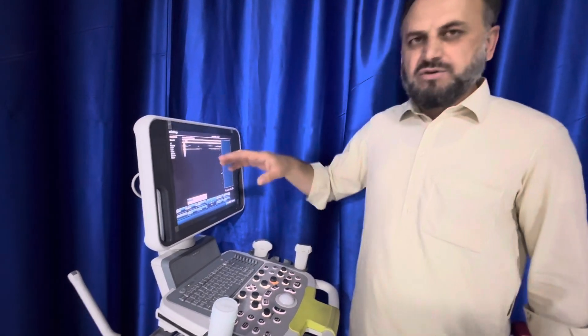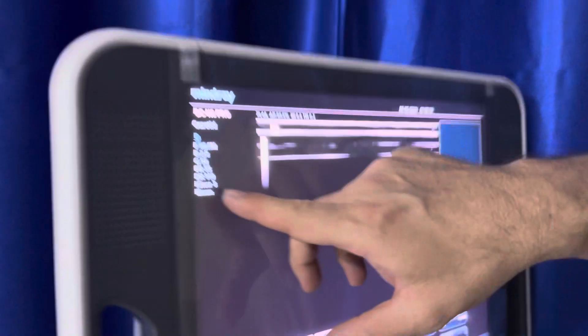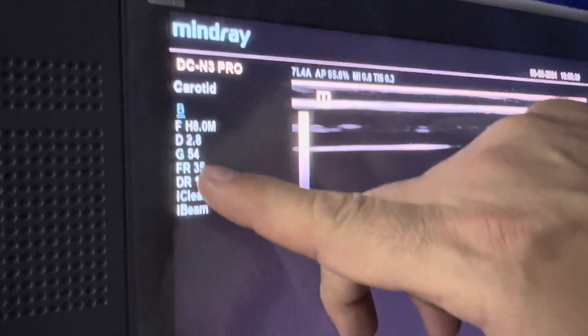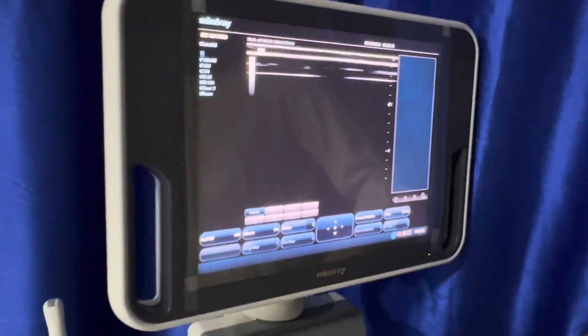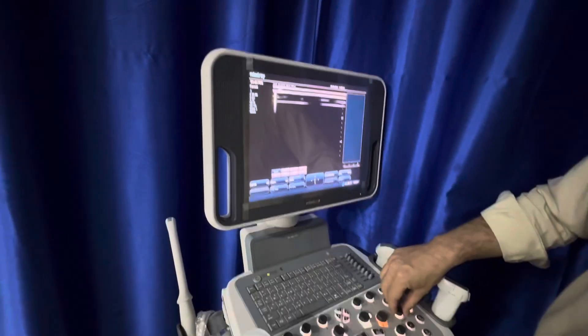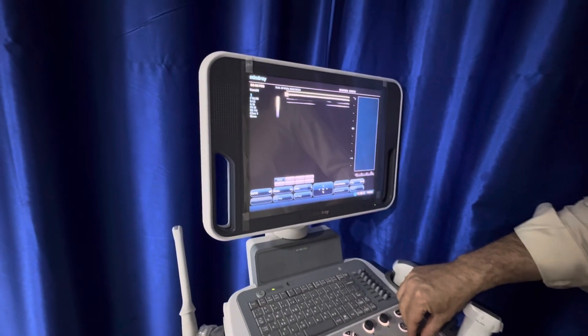Let's see about the frame rate. Now you can see here on the screen that the frame rate is 35 frames per second. Let me change the depth. I will change the depth from here.